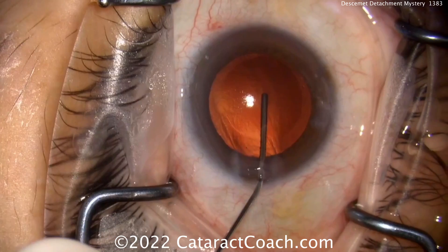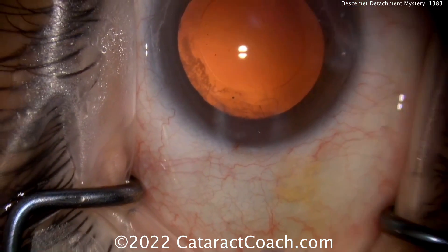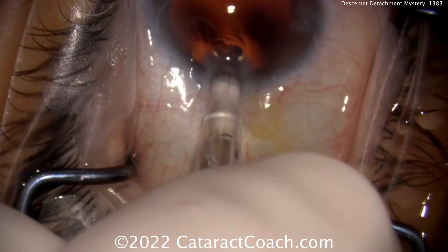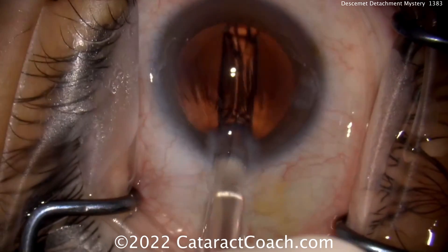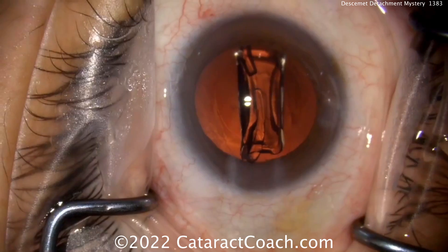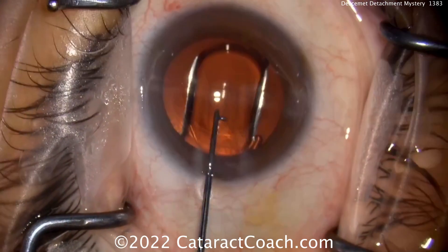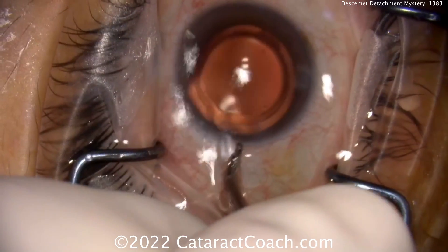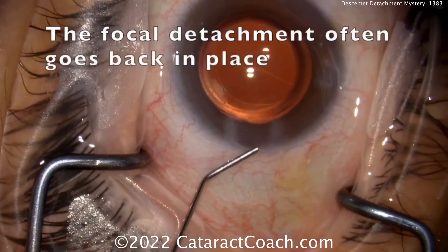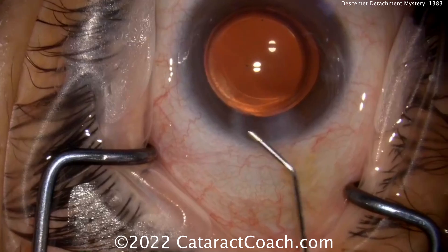The architecture looks pretty reasonable, and now finishing up the case you can see there's a significant Descemet's detachment. If you've done corneal surgery like DSEK or DMEK, you know how easy it is to detach Descemet's. There it is — the detachment is visible. Now the lens goes in, delivering it nicely into the capsular bag. Lens insertion is often where you can get a Descemet's detachment, especially with a twisting technique, which I'm not a fan of. At the end of the case, removing the viscoelastic, there's the focal detachment going back into place — which is great.